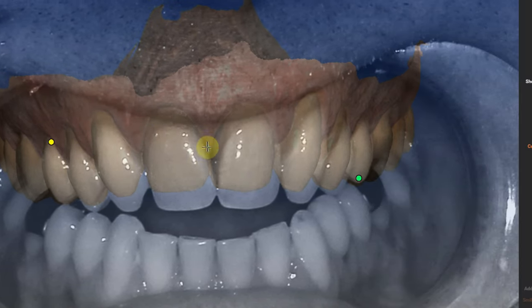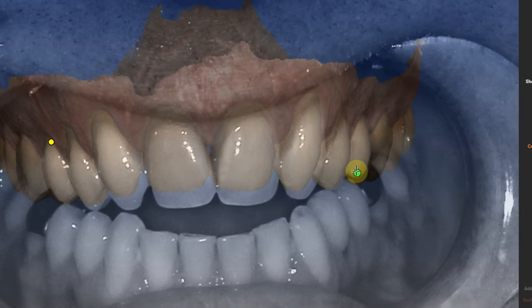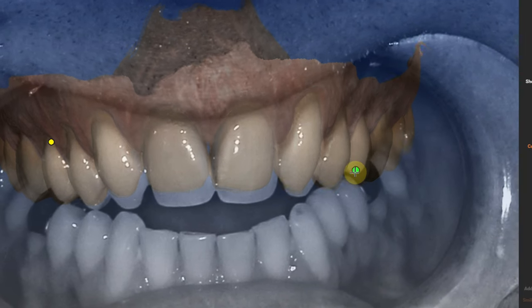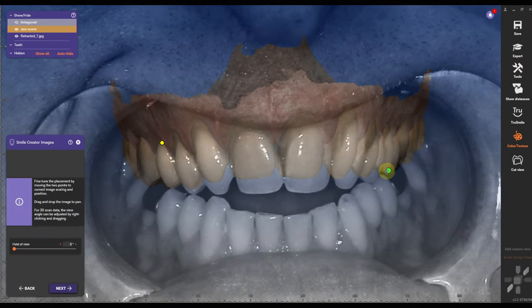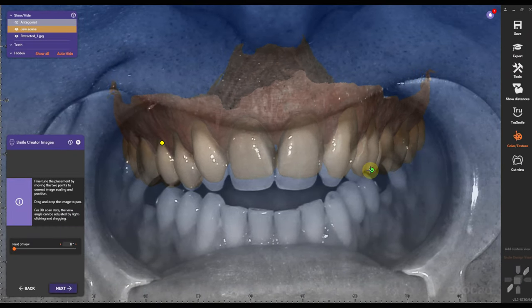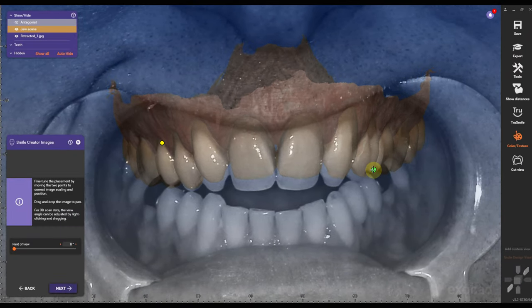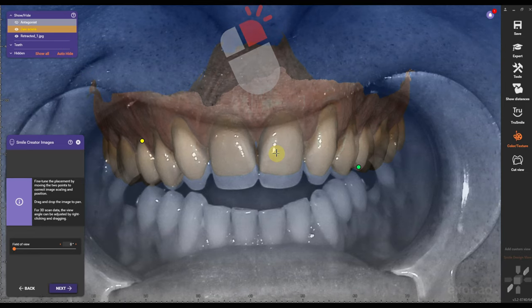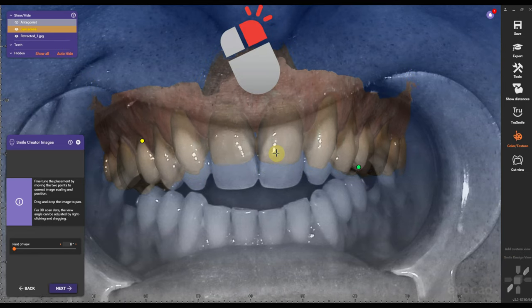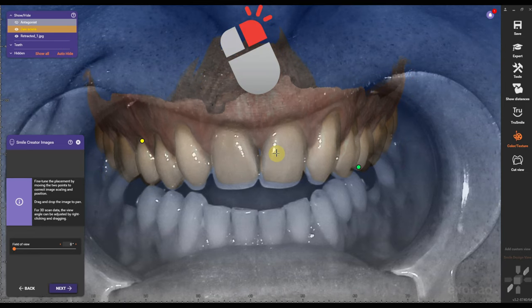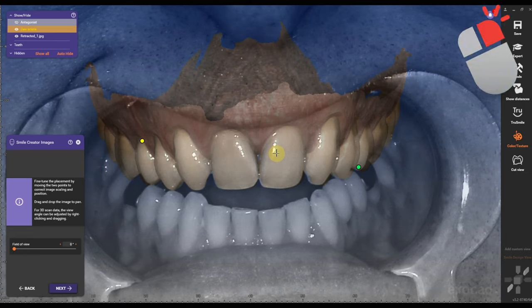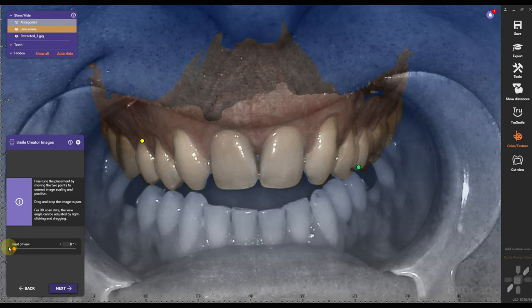If I press the left mouse button, I can move the picture up and down. I can also drag and resize the picture. If I press the right mouse button, I can change the orientation of the actual scan.